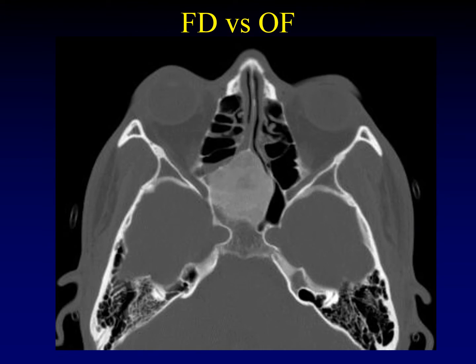Here's another example to drive home this concept of whether we're dealing with fibrous dysplasia or ossifying fibroma. Here is a ground glass lesion sitting along the anterior aspect of the clivus or coming from a wall of the sphenoid sinus. What's the configuration? Is this the configuration of an underlying bone, or is this a spherical configuration? This is almost a perfect sphere — this is an ossifying fibroma, not fibrous dysplasia, no matter what the pathologist says.